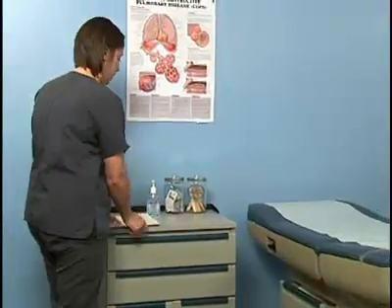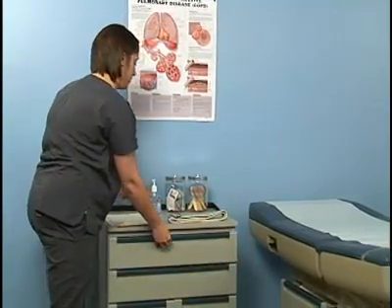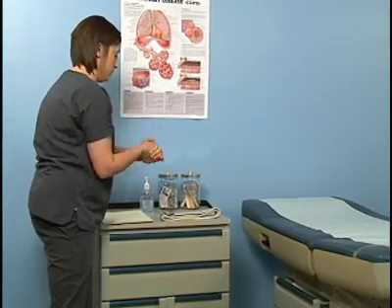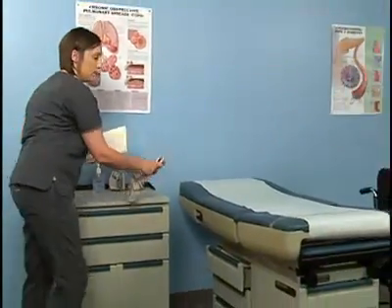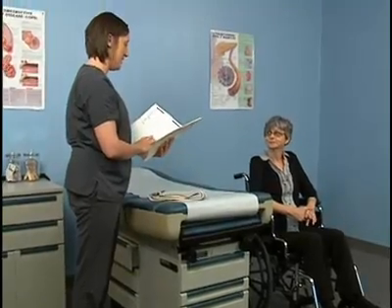Obtain a transfer belt before you begin. The belt provides a secure grip and helps you control the patient's movements. Sanitize your hands. Greet the patient and introduce yourself. Identify the patient and explain the procedure.